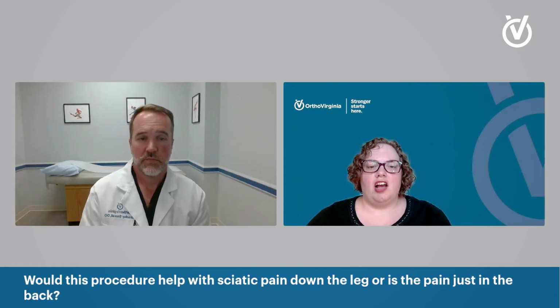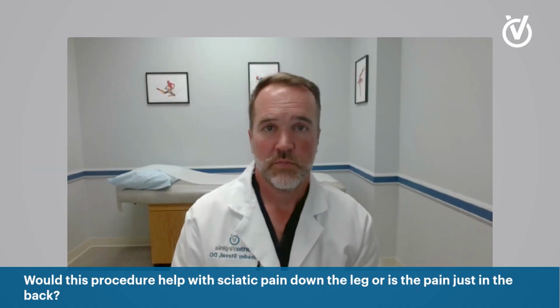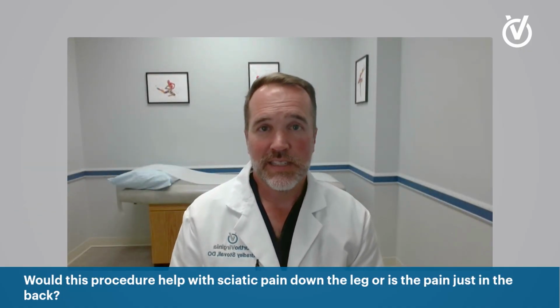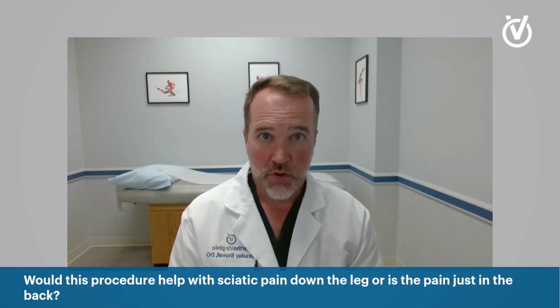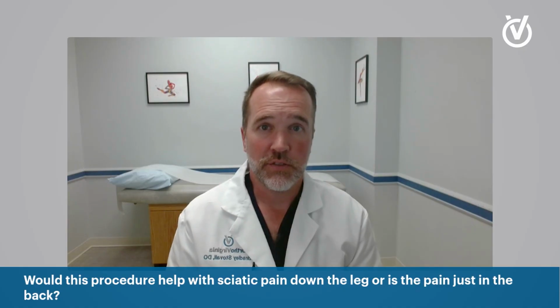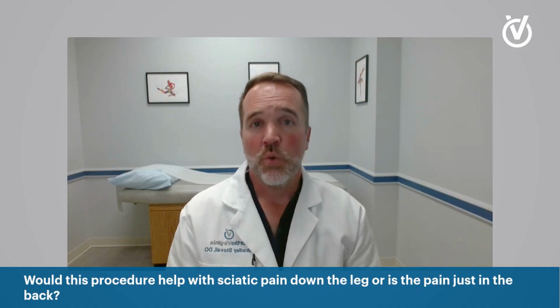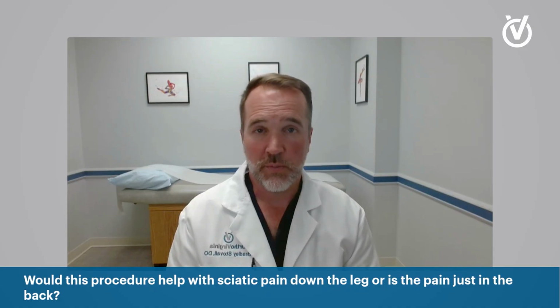Would this procedure help with sciatic pain down the leg or just the pain in the back? So this is a treatment for chronic back pain. It does not address any sciatica symptoms. So typically, if you just have chronic back pain and the sciatica symptoms are really not the major concern, this would be a possible option. If you do have a lot of sciatica symptoms, we like to approach that first. We always try to protect the nerves first, calm down nerve inflammation before looking at some of these chronic back pain treatments.